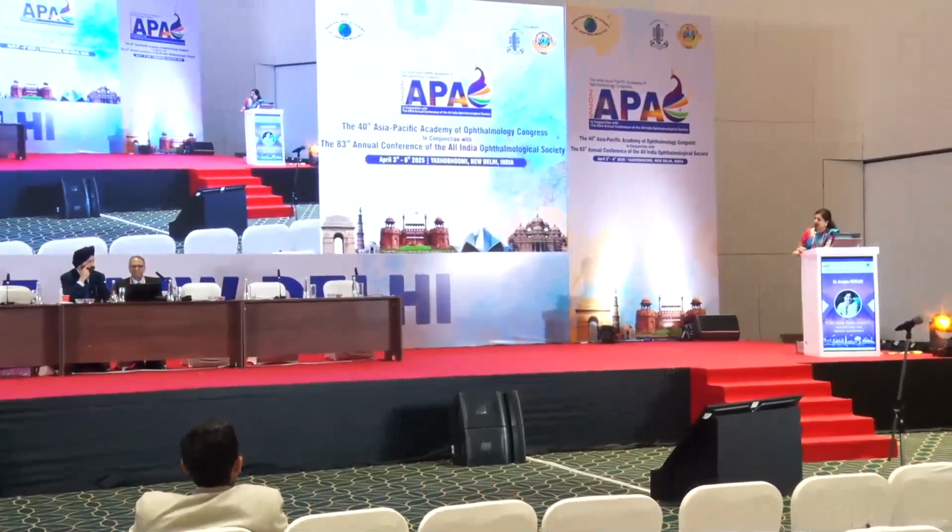So formula? You would know from the topography that it's a hyperopic LASIK. So you would not use a negative aspheric lens. You would use a positive, a routine IOL, because there would be a negative corneal spherical aberration. So that would be the type of IOL. But when you put it on the ASCRS online calculator, you have multiple forms. You choose the post-hyperopic LASIK and then put in your K1, K2 values, and then you can get the IOL power desired.